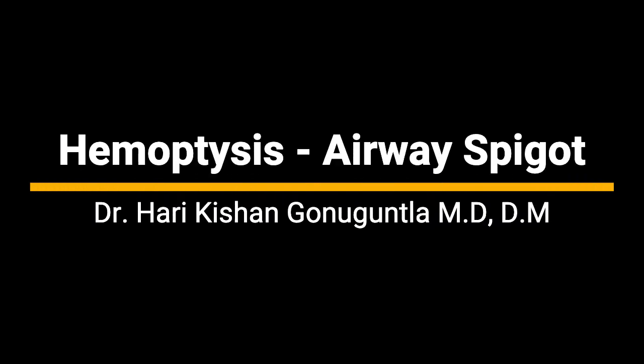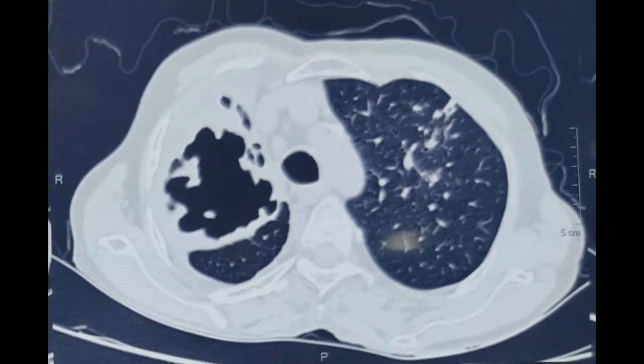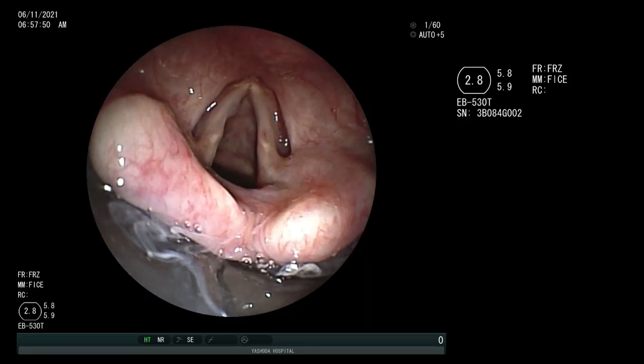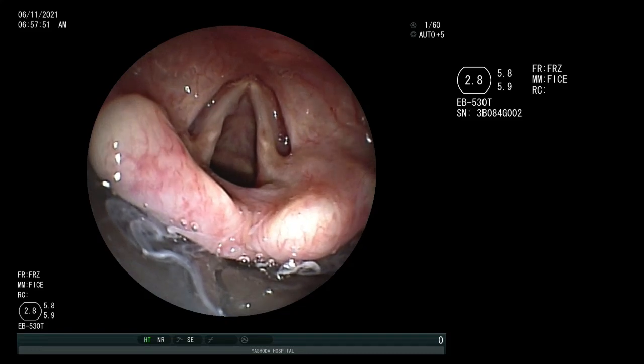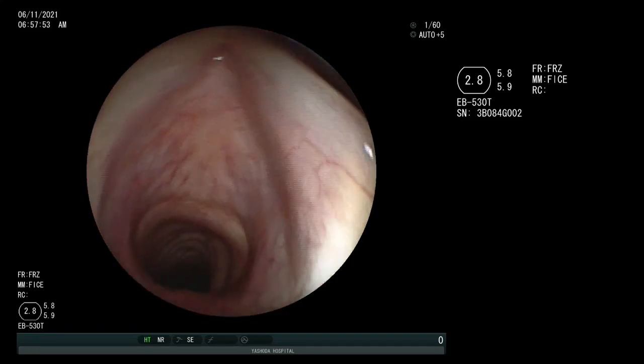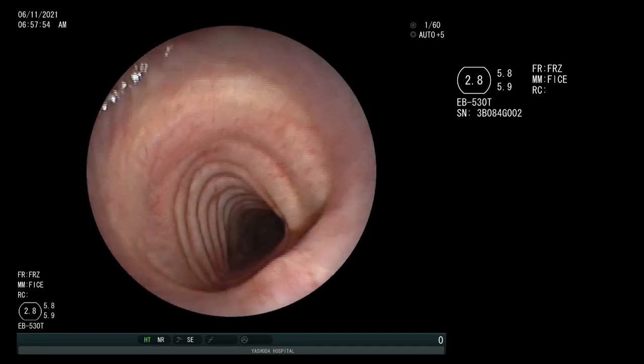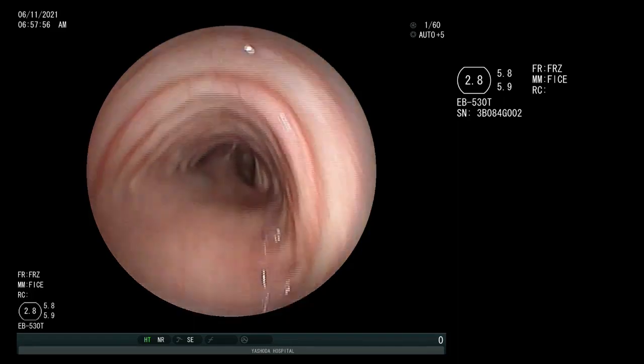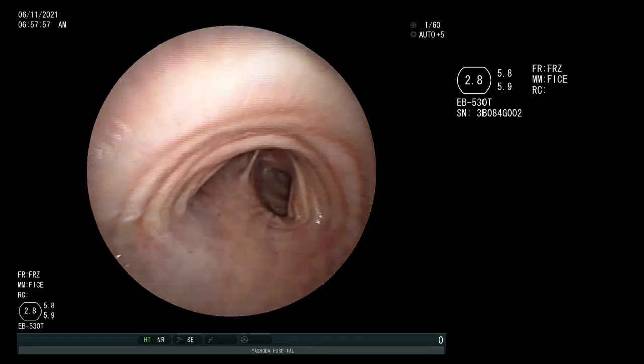Hi. From the Division of Interventional Pulmonology, Yashoda Hospitals, we present a case of hemoptysis secondary to reactivation of pulmonary tuberculosis presenting as a large cavity in the right upper lobe. In this video, we describe the placement of endobronchial spigot in the right upper lobe posterior segment using the side grasping technique.